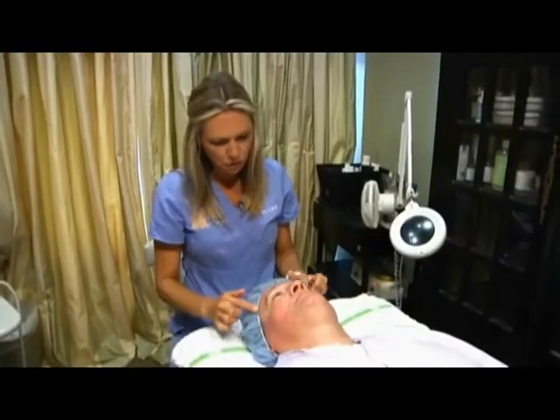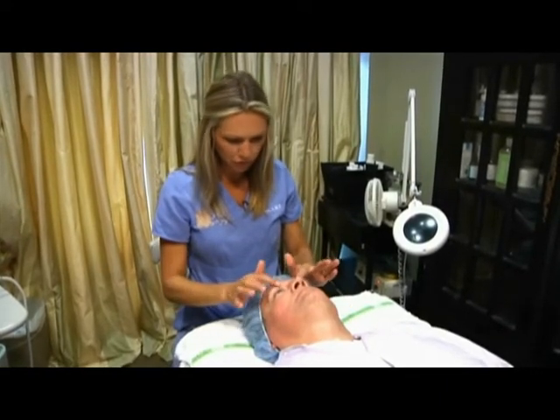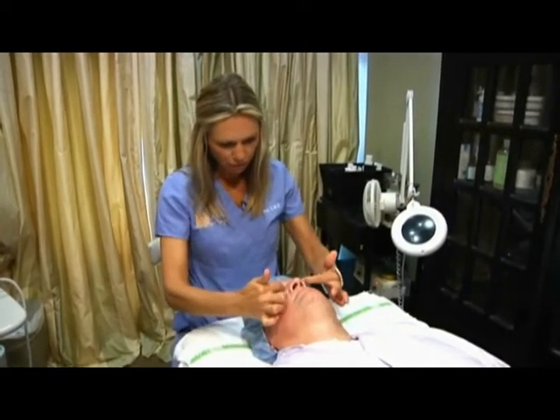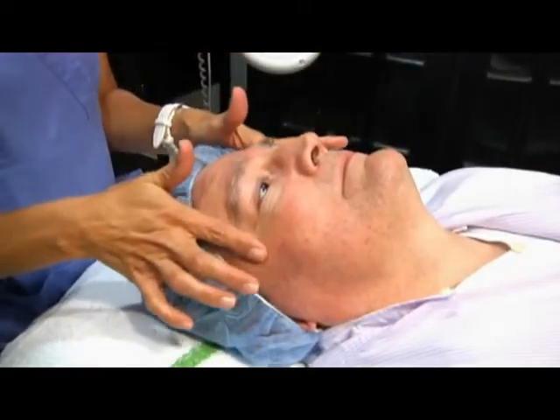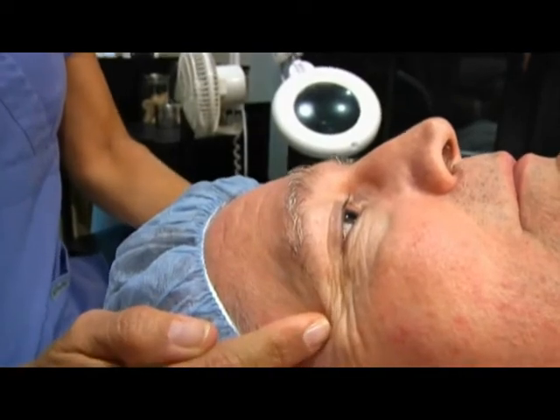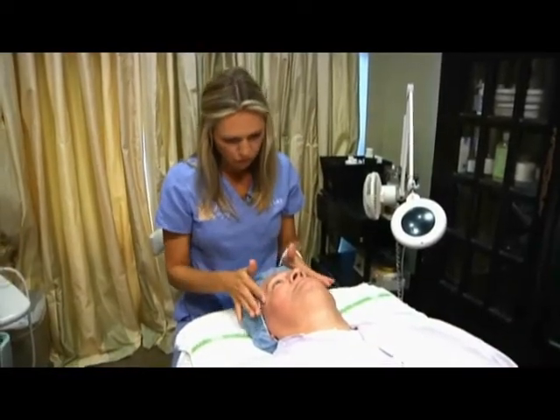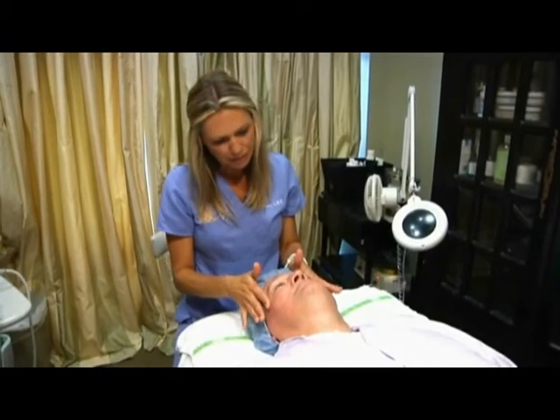Okay, and with the upper portion of the face, we're going to get a little bit of a brow lift here, which will help with the hooding. We'll also go around the orbital bone right here and help with some of the bags that people get up under their eyes. You're not very wrinkled at all. We're going to also lay a few lines right through here, and it'll help to firm and tighten where people normally get crow's feet.